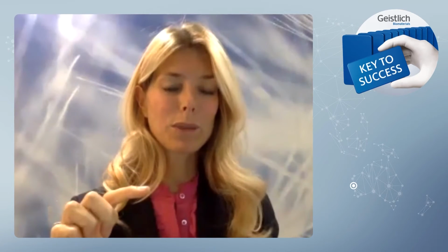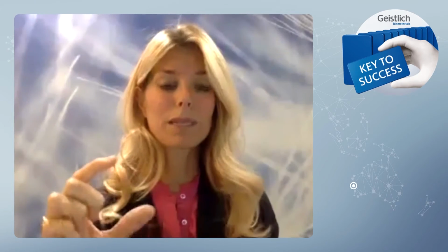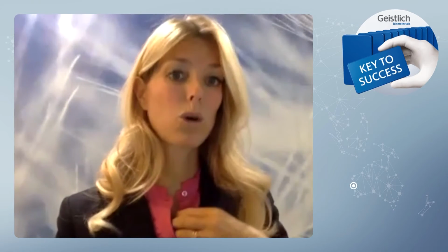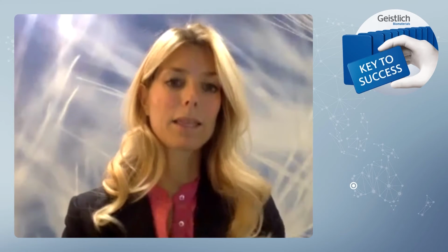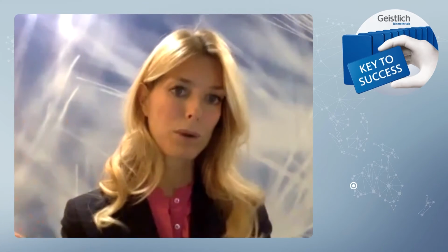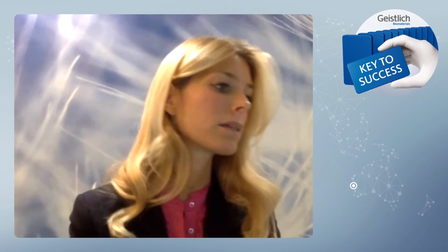Now, what happens with them? It's very simple. You remove it, because obviously you can't leave a screw, because that will probably be the position of your implant. So it is left for the 6 or 9 months of healing, and then it is removed when the implants are positioned, at the same time as PTFE membrane removal. Screw removal, implants inserted. That's the protocol.